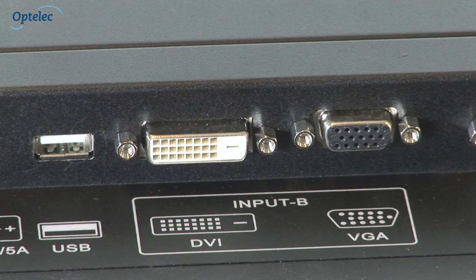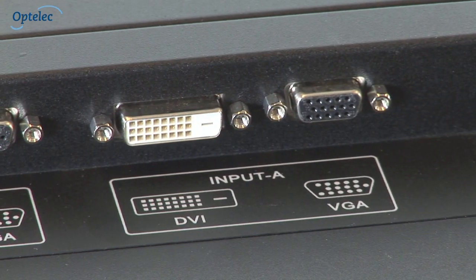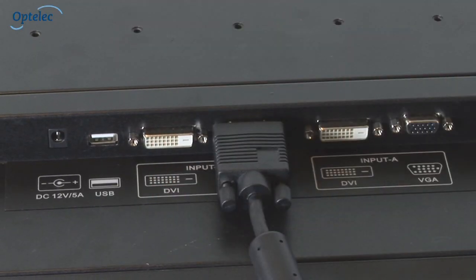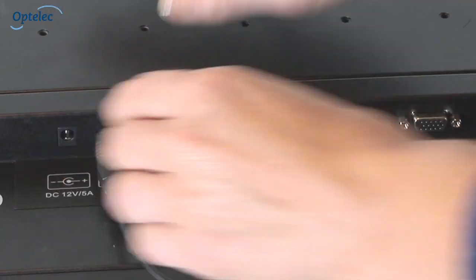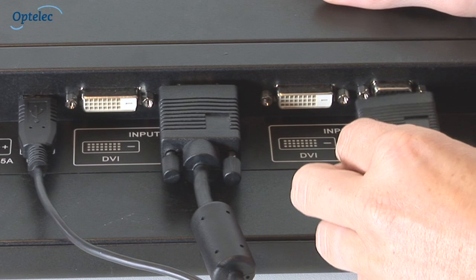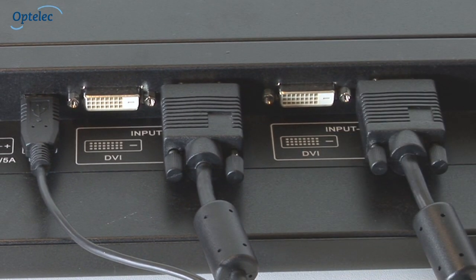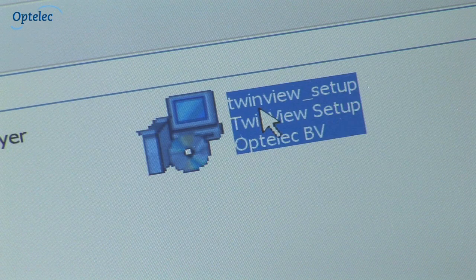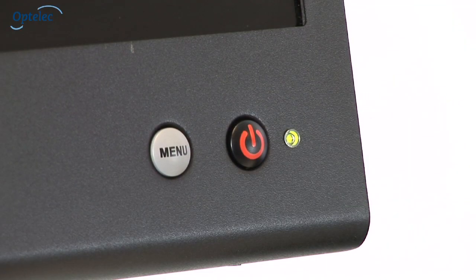You can be up and running with the TwinView very quickly. A single USB and two VGA and DVI connections are located beneath the TwinView. Connect the computer to the USB port and to channel B using either the DVI or VGA connection. You can then connect the Optelec ClearView Plus or another video magnifier to channel A. Install the included TwinView software to the computer and then power on the TwinView using the on-off button.